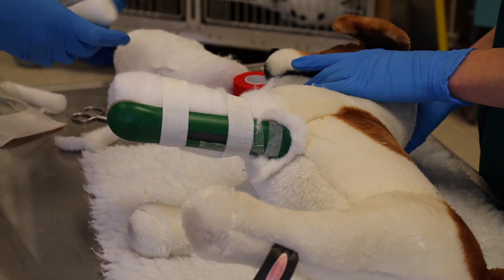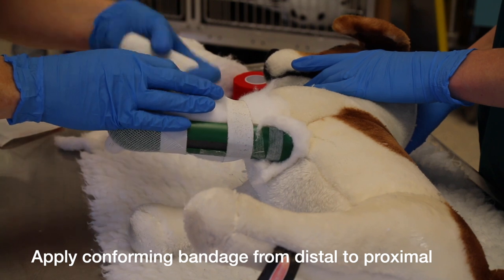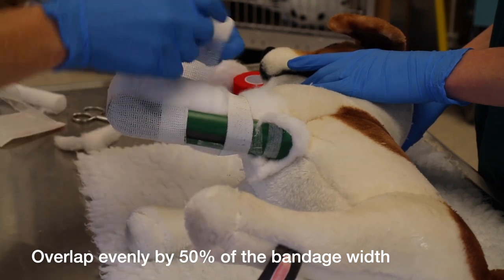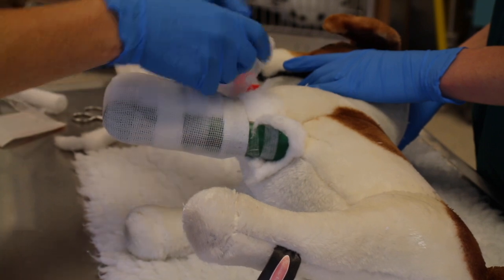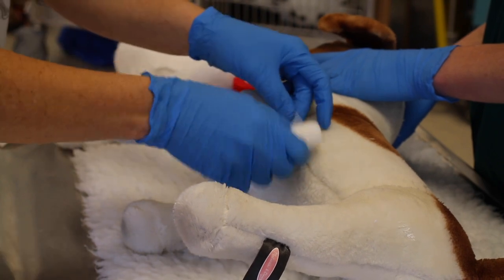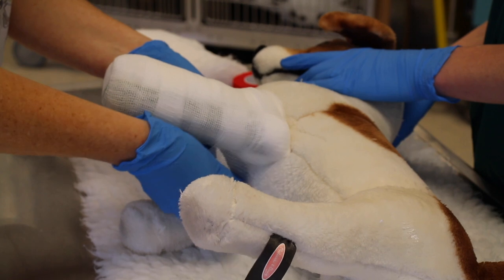Now we put our conforming layer on. Again, we start at the foot and work distal to proximal. The same principle applies — we're going to overlap by 50% with each turn. We're going to go right up and incorporate the end of the splint around it.